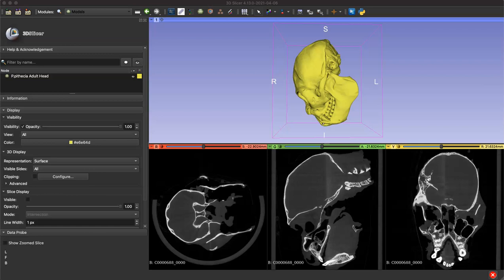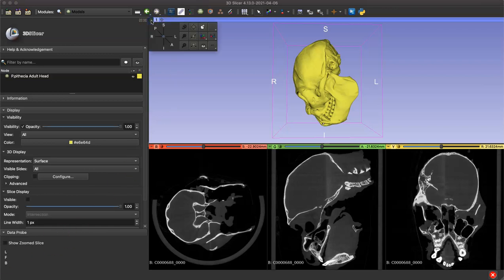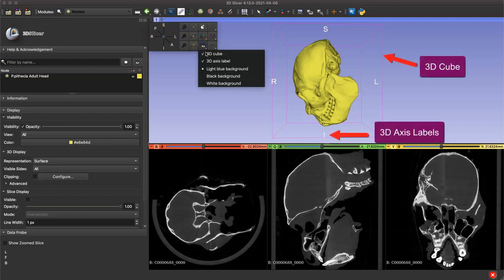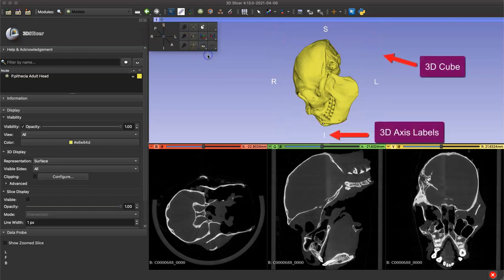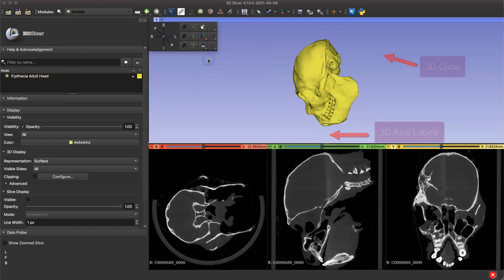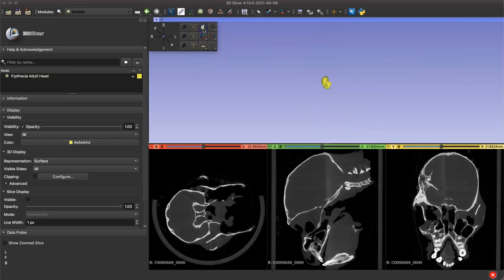Our volume and model are already loaded into slicer so we can begin. First we'll customize our workspace by clicking that pushpin and then the eye symbol. You can remove the 3D cube and the axis labels surrounding your model. This isn't necessary but it might help with visualization.